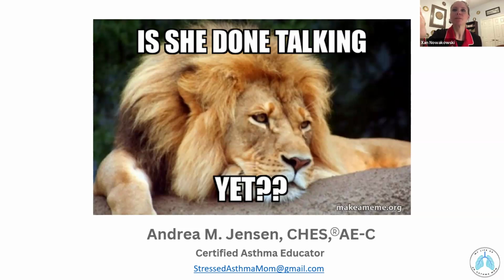I have one of those big baby bottle sterilizers that I use for my devices, and it works great. I should have added that in. Someone else mentioned that. Almost everyone I know in the CF community has one of two different types of large microwave baby bottle sterilizers. It's like we all have certain equipment.